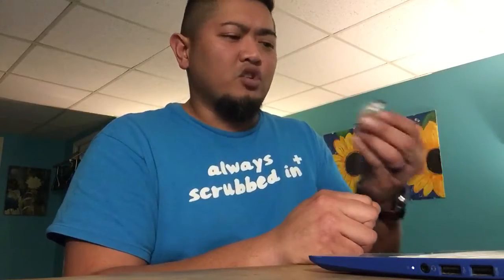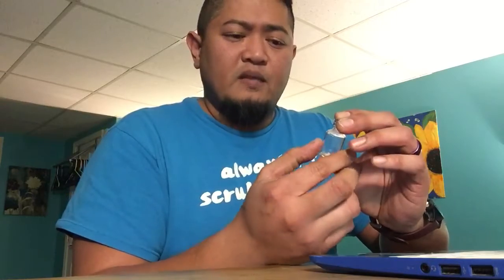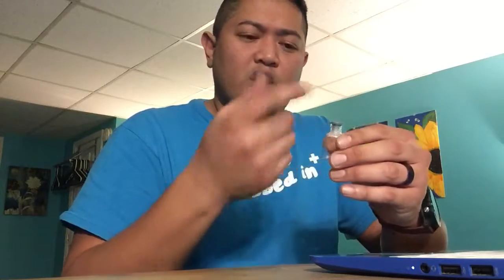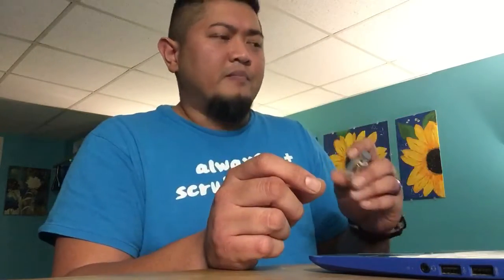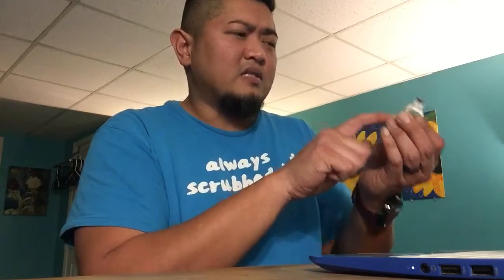We have to make sure that the vial or the medication is not expired. So you check the expiration date, make sure the vial is intact, that there are no cracks, it's not opened, or anything leaking. And then we're going to do our first 6 rights. We're going to check the patient's name: Diabetes, date of birth 12/12, aspart insulin, sliding scale, given subcutaneously, and it's going to be given at 12 o'clock, which is right now.